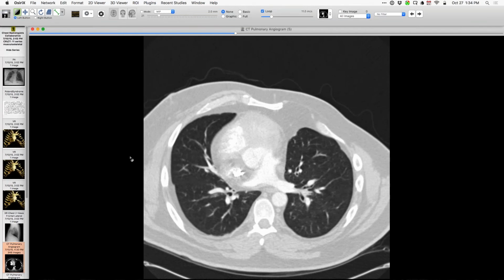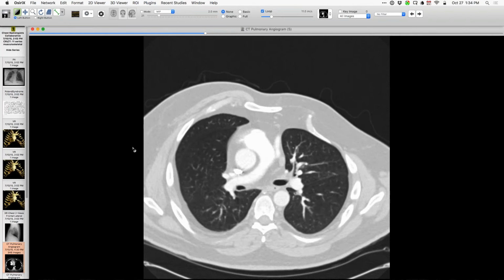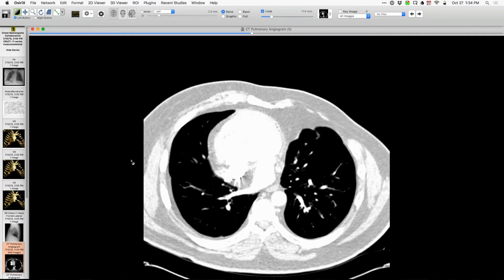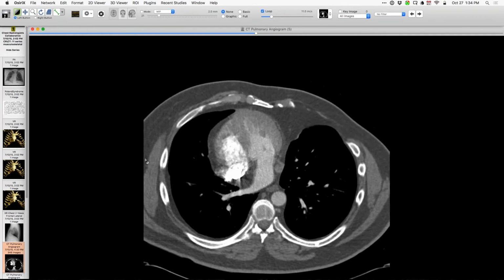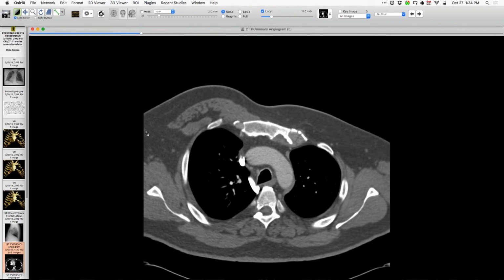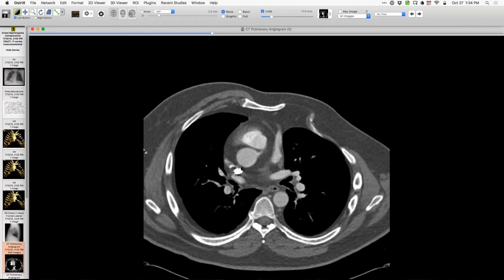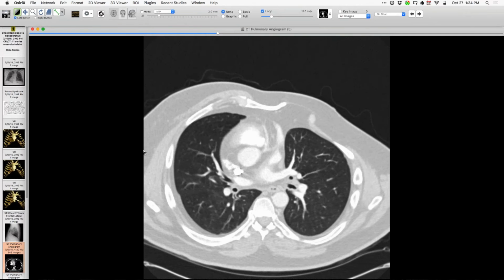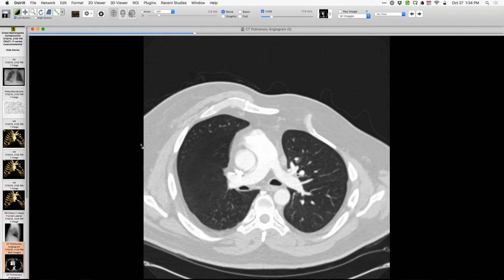And would you guys agree that this is just called a dextro-positioned heart? It's just rotated. The left hemithorax is maybe a little bit small. But I don't see anything else related to the heart structurally. It is a bit dextro-positioned. Now, the airways are normal. The lungs are typical right and left. We have bronchi, two lobes. Yeah, I believe so. Right middle lobe, lower lobe. Yeah, I think they're okay.